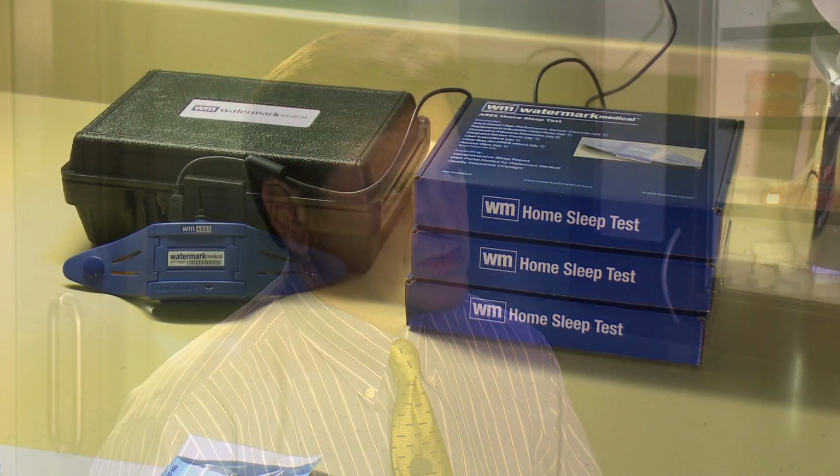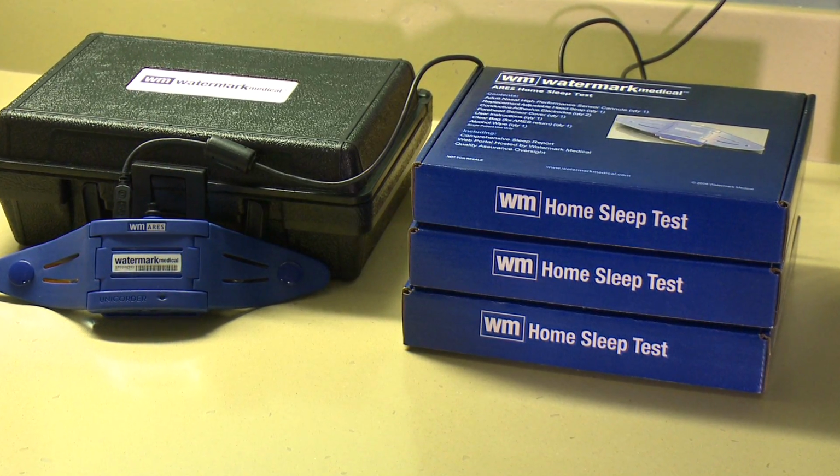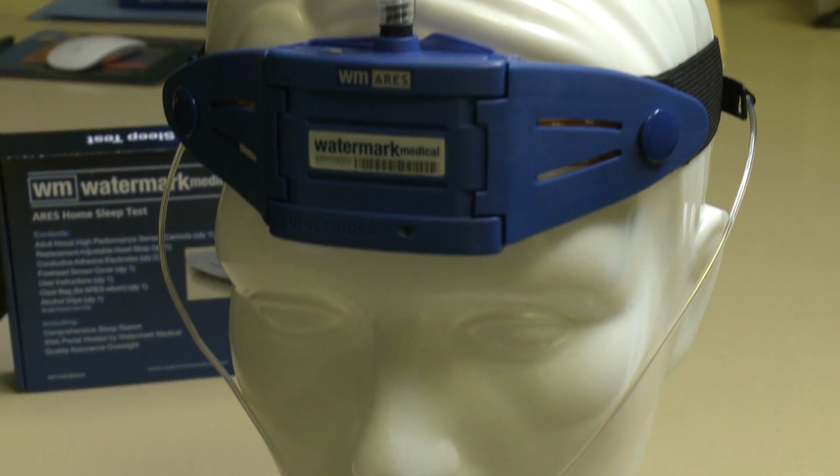Absolutely. An overnight study, a polysomnogram, is really the traditional way of diagnosing the severity and the presence of obstructive sleep apnea. It also checks a lot of other things that really aren't so tightly related to obstructive sleep apnea. So these days, when we're trying to screen people and have some compliance on them actually showing up for their test, we've developed what they call a home sleep test. That's easy to add to the patient, give them the instructions on how to work it, and it's really diagnostic in finding out who actually has obstructive sleep apnea, primary snoring, or other severities of sleep disorders.